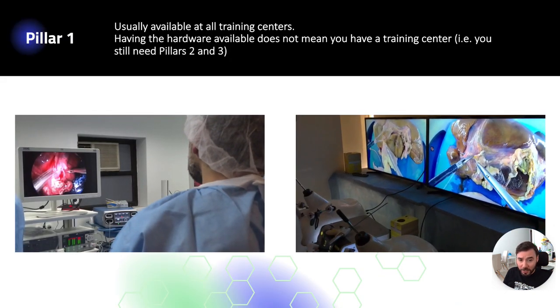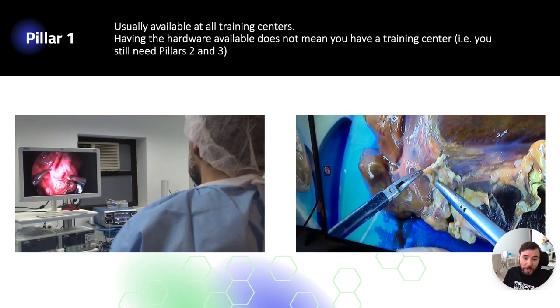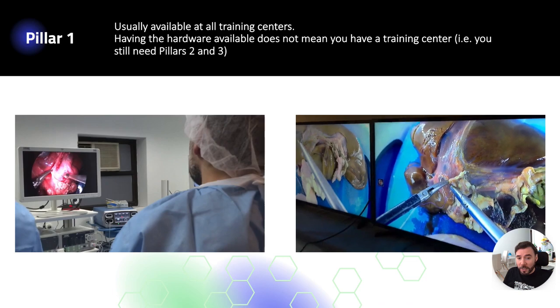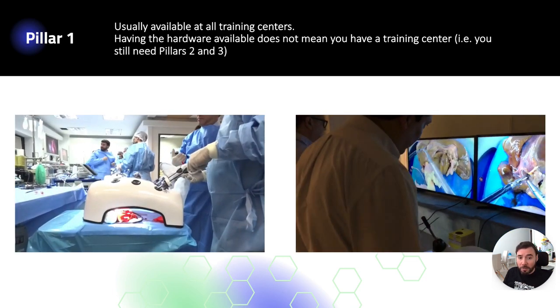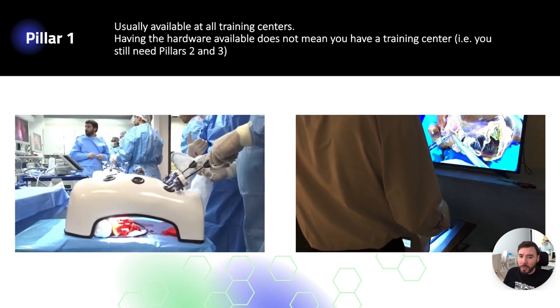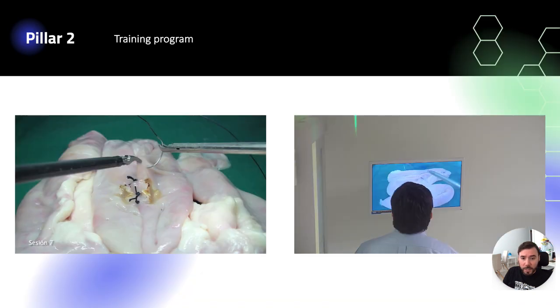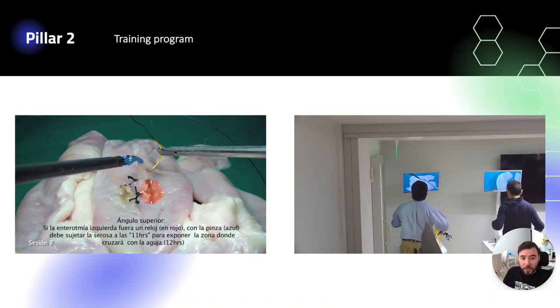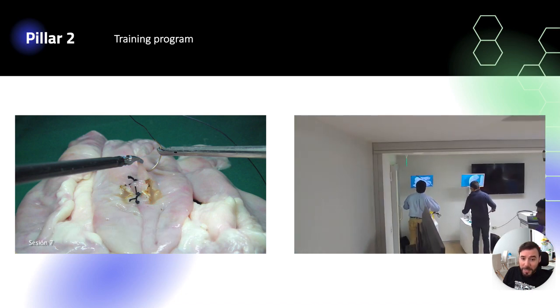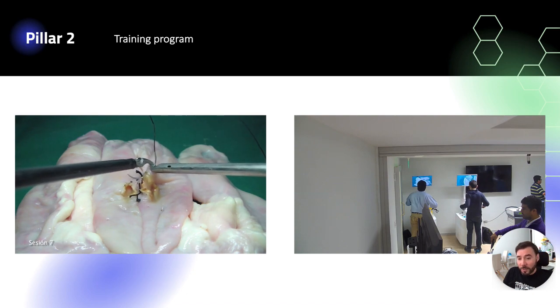This is just an example, I'm a surgeon, of one of the first pillars that I used to train surgeons in advanced laparoscopy. Most simulation training centers have first pillar like phantoms, real scenarios, replicas, etc. Let me show you a second pillar. This is just as an example. Remember, I'm a surgeon. Here, we want to train resident surgeons to perform a complete bowel anastomosis.